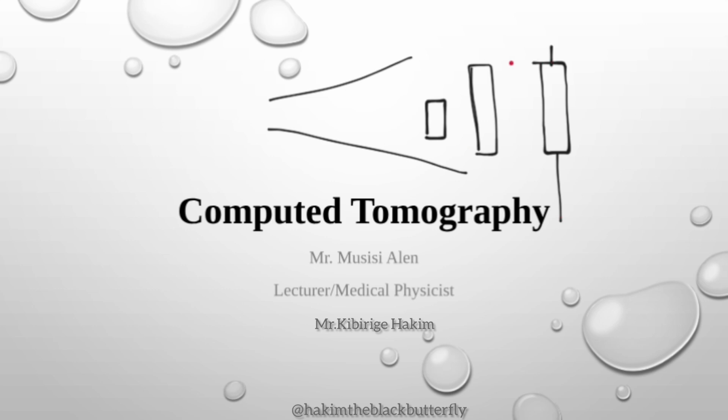If this is the image receptor, you will see an image of the big one. The smaller one will also be there within it, but you won't be able to visualize it well because it is overlapping onto the big object. So those are projected images. Overlapping objects, you won't be able to differentiate them.